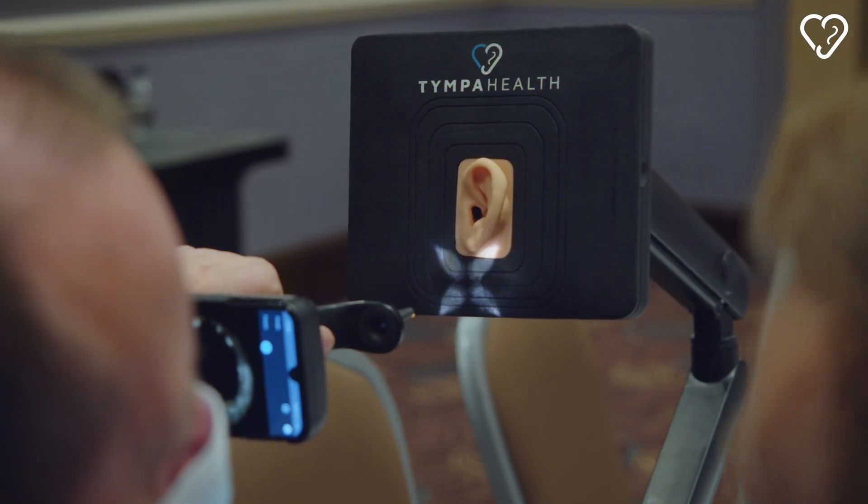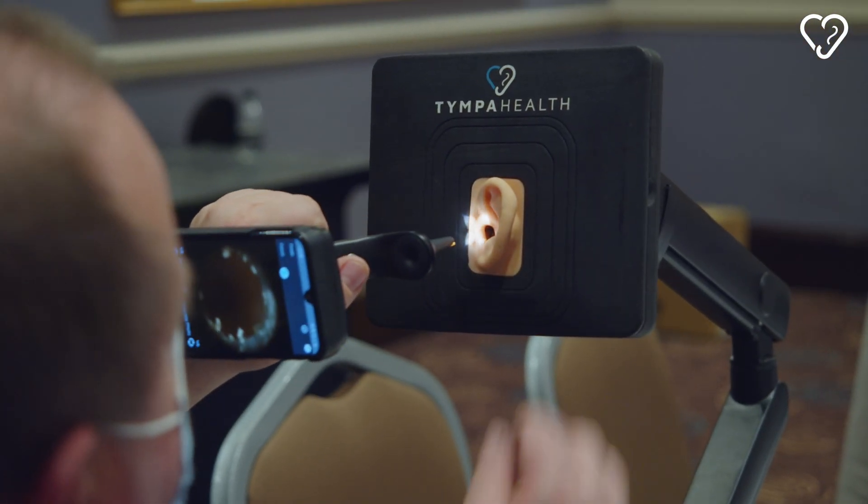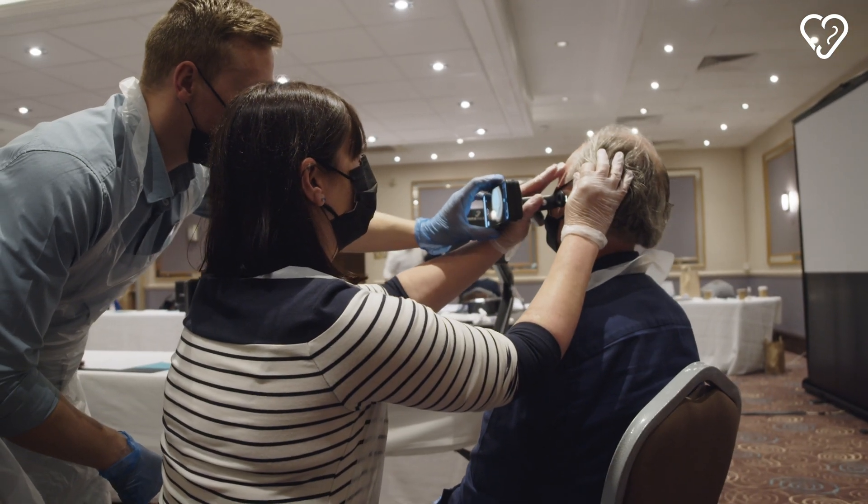The learning curve — or the step up from using a dummy simulated ear to the real thing — can be huge, but not with these. The confidence for the person that's learning the skill is such that they can just take a small step from the simulated head to the real thing and they're much more confident.